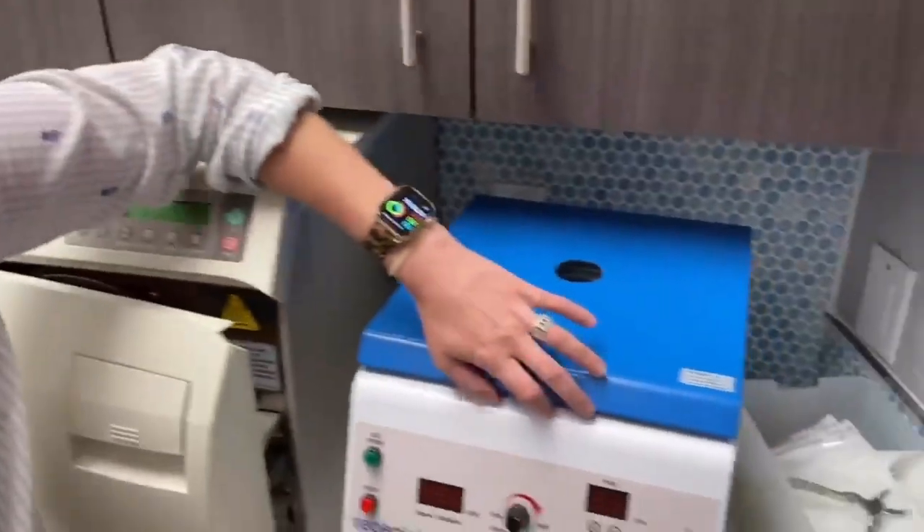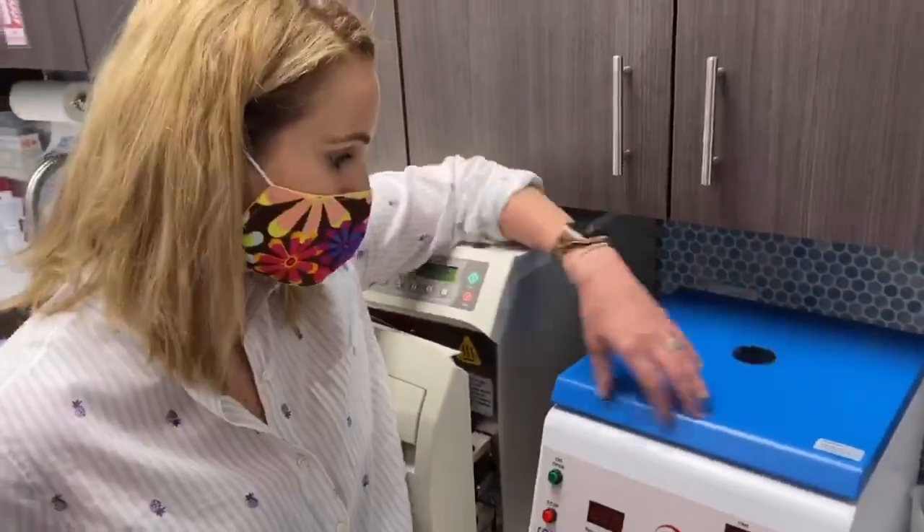After we take the tube, we're going to centrifuge it. This machine here is called a centrifuge — we open it up and just pop the tube in there. After we get it out of the machine, you'll see it'll be in two different colors: red on the bottom, and on top the concentrated platelets. The red stuff is actually proteins, red and white blood cells, as well as water — we discard that. Then we take the yellow portion, which is the platelets and activating growth factors, and inject that directly into the area.